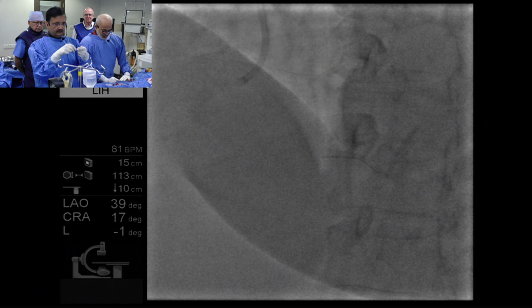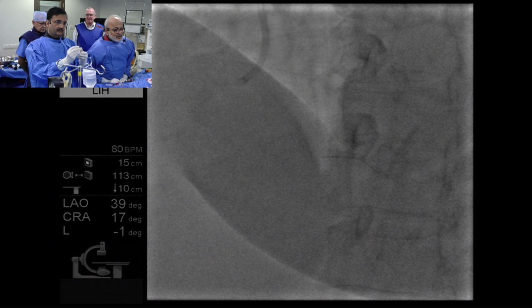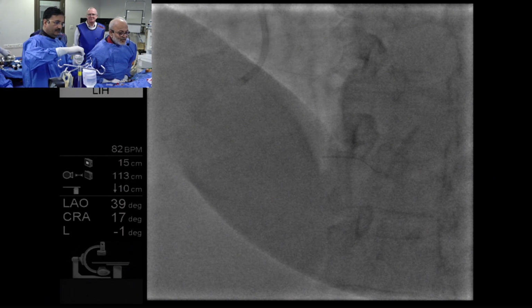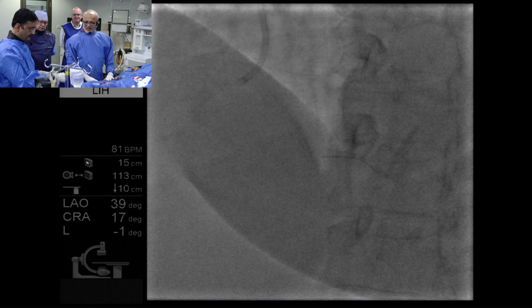So Tejas, I'll tell you something a little different. I don't put anything in the rota except saline. Nothing at all. I just give a little nitro before I start the run, and that's it.